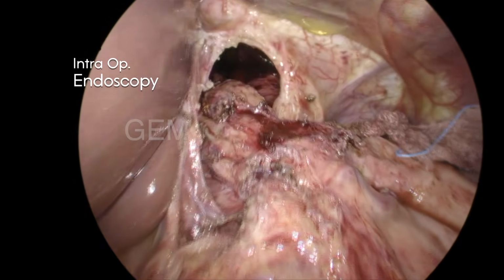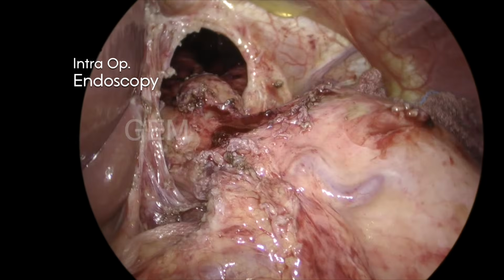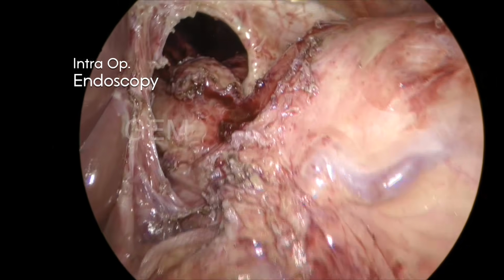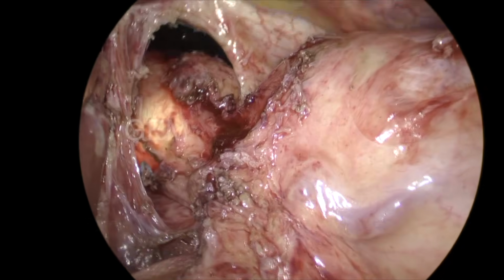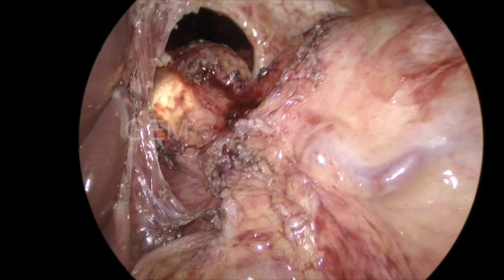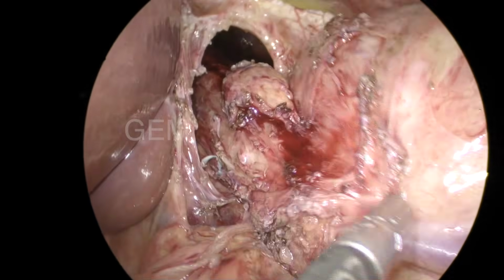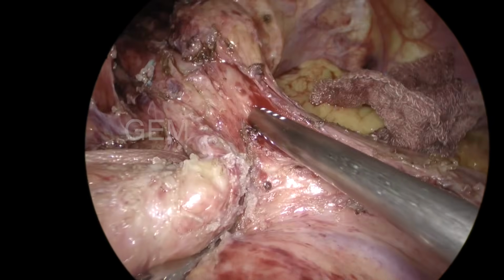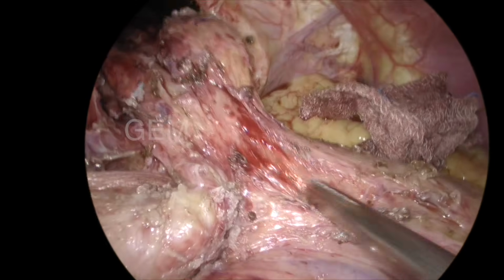This surgery was done long back in COVID time, almost 6 years before. Now you can see, but I couldn't see any light. Only on the esophagus side I could see the light. On the stomach side I am not able to see the light. That means the muscle is there. They are also telling that some resistance is there near the OG junction.